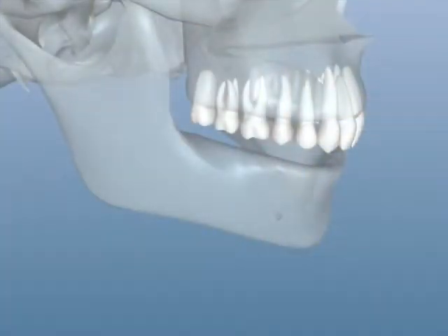Despite thorough planning, surgery may reveal that the patient's jawbone is inadequate, and it may not be possible to complete the planned implant placement. And because each individual heals in a different way, there can be no guarantee of the functional or cosmetic outcome of the planned surgery. Informing patients of the risks associated with dental implant surgery allows them to make decisions about their treatment and have realistic expectations about the results.